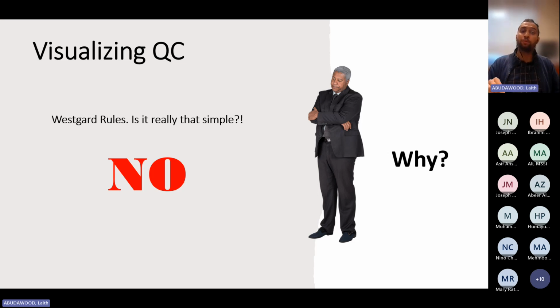Westgard rules must be applied when you have established your lab means and lab limits. I will say it again. Westgard rules should not be applied in general to manufacturer ranges. Okay? They should be applied when you have established your lab means and lab limits. I don't want to go further, because it will consume a lot of time, but this is very critical.